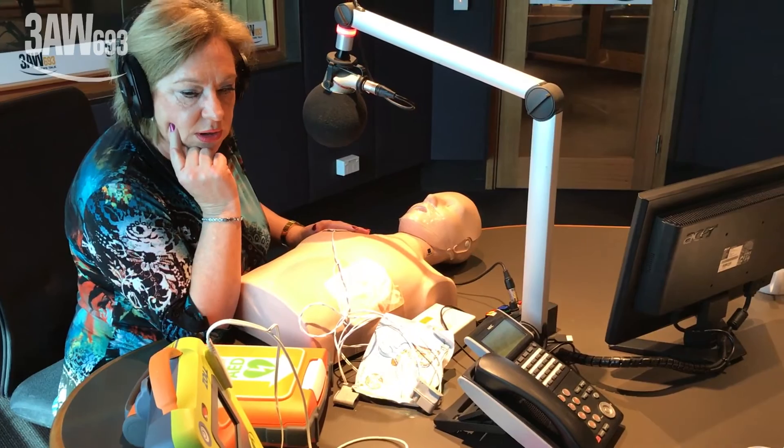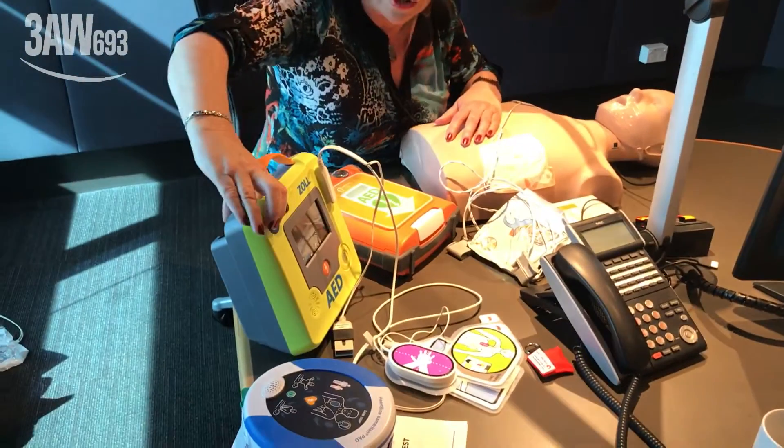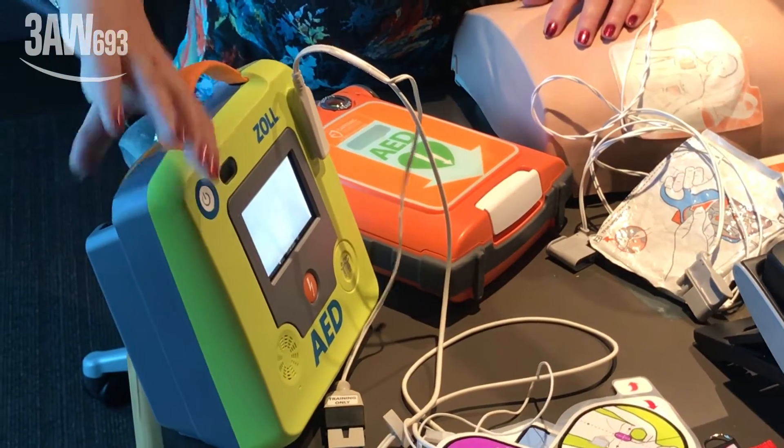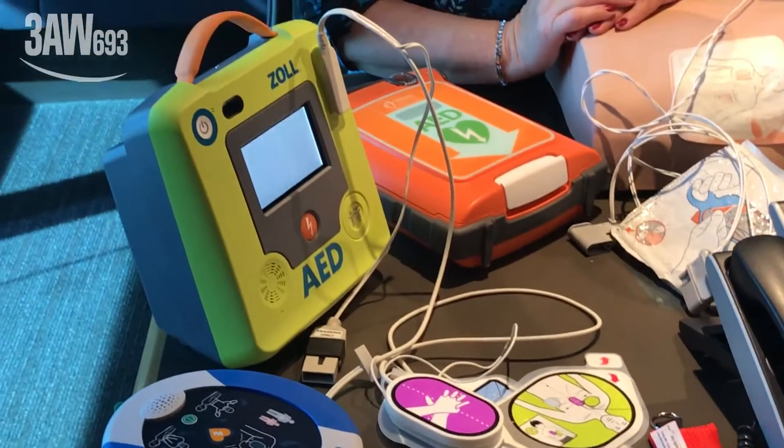That was one model. There's another one here — the Zoll AED. Is it a similar sort of product? Yes, it's a similar thing. They can turn it on as well. The one just used was the Cardiac Science PowerHeart.